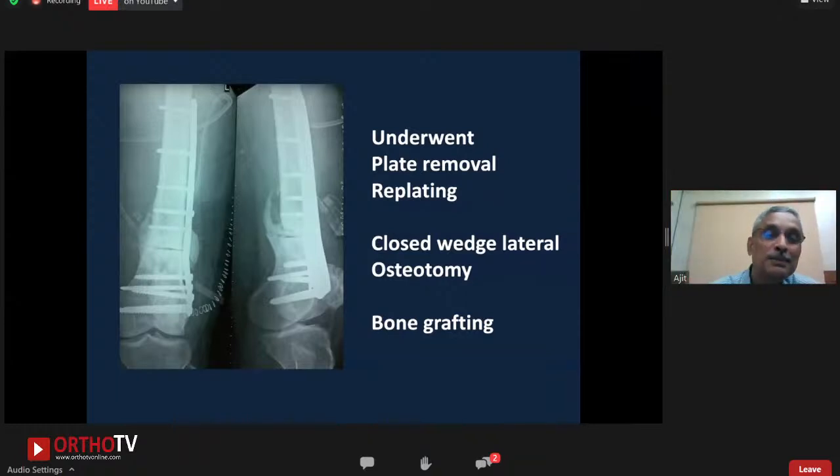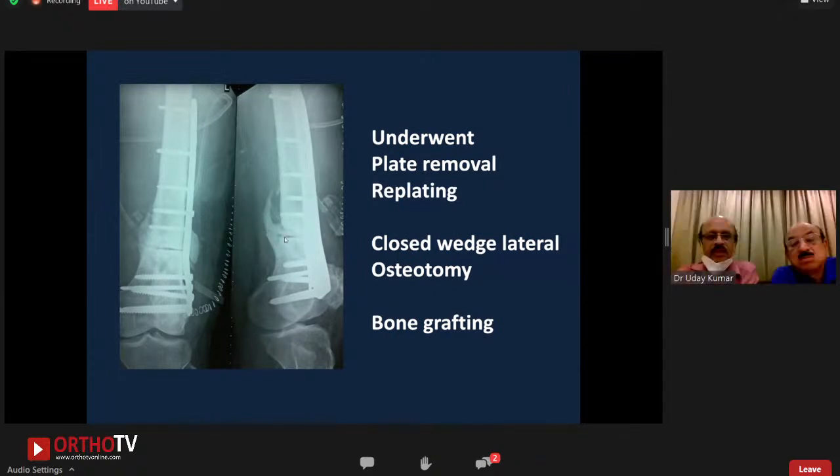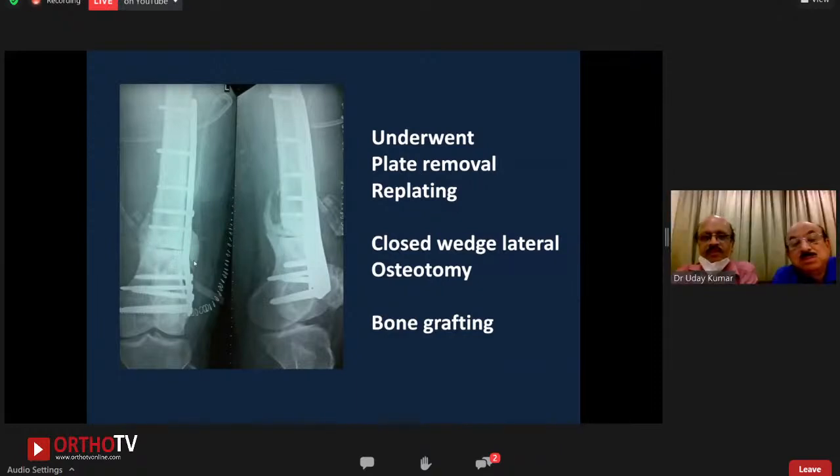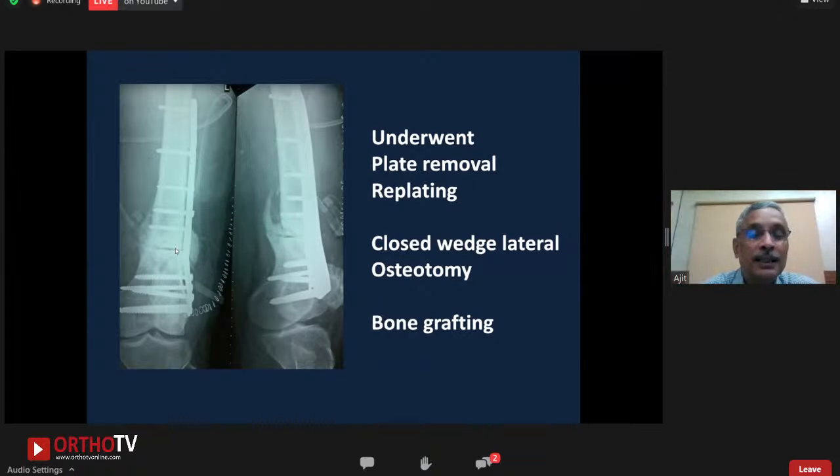May I just comment here? Yes. The bone at the original fracture site looks very dense, and I think this is what Professor was saying about resecting the non-union site. This area, right? This whole area looks very, very dense. So maybe more resection should have been done. I would have been tempted to resect the dense sclerotic bone, get in much more bone graft, and then compression plating.